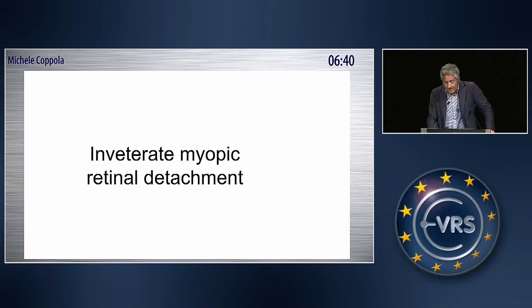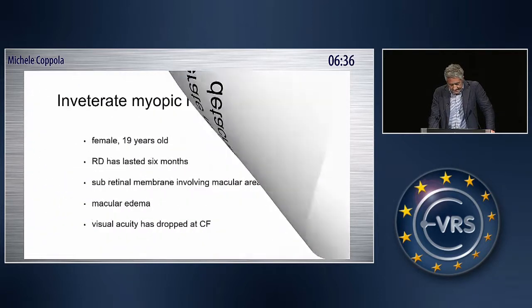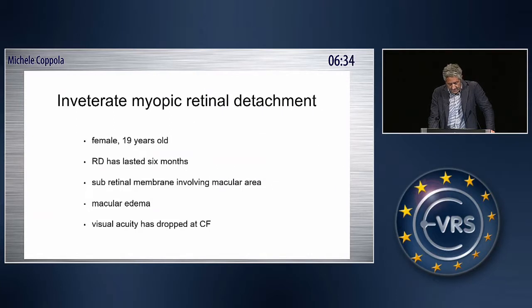Okay. So, an inveterate myopic retinal detachment. She's a female, 19 years old, with a retinal detachment that lasted 6 months, already with subretinal membrane involving the macular area. Of course, macular edema. And at the time of the surgery, the visual acuity had dropped to counting fingers.